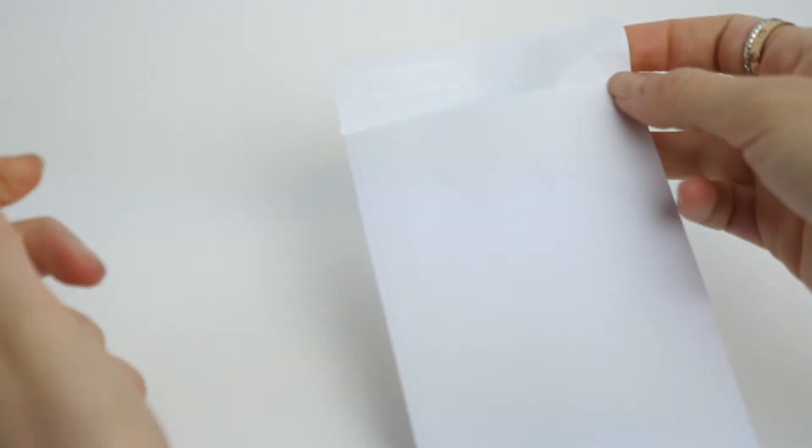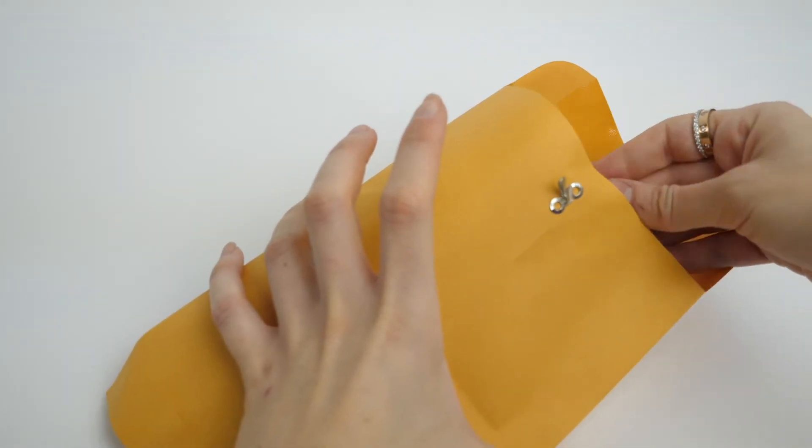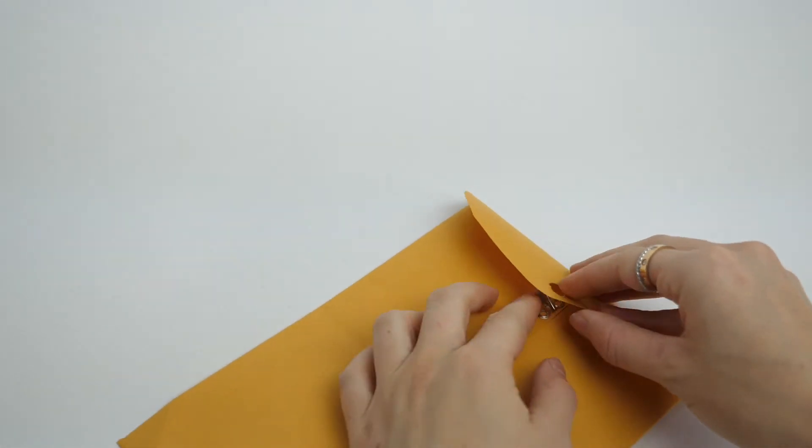Repeat these same steps for the other participant. When both sample envelopes are sealed, place them together with the consent form in the return packaging. Seal the package and drop it off at any UPS Dropbox.